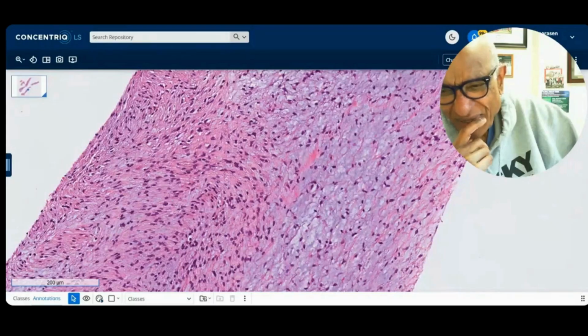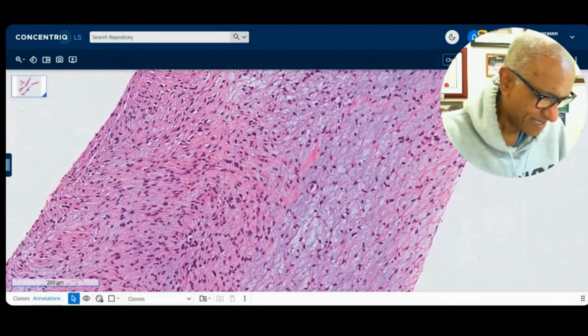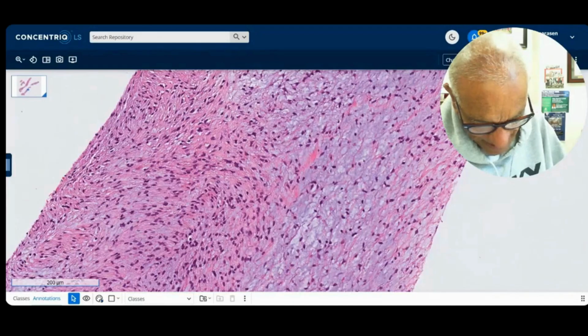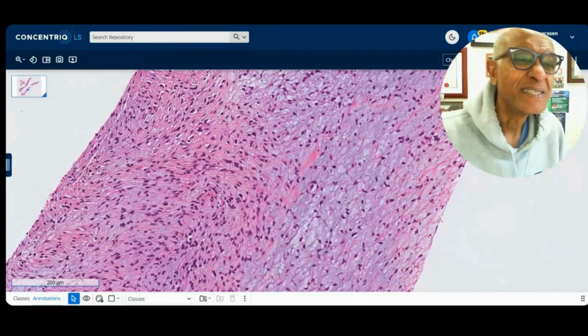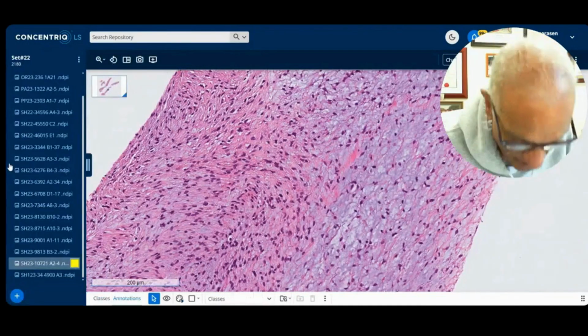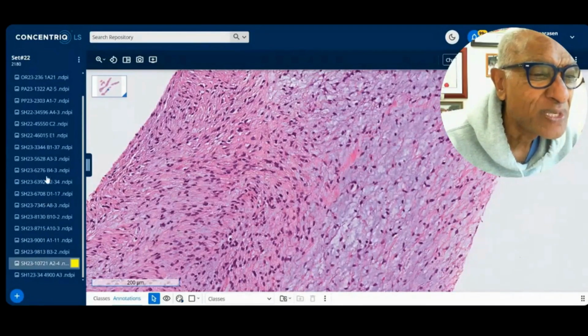All right, I'm glad you guys are having fun. Anytime. Yeah, that's the reason we get together and chat, right? Let's show you another case. Oh no, I'm on the wrong screen. And this one is 6276. There we go.